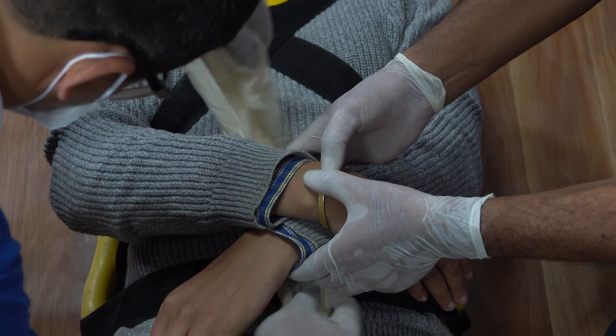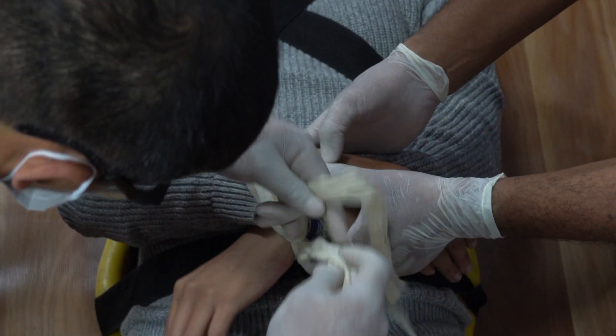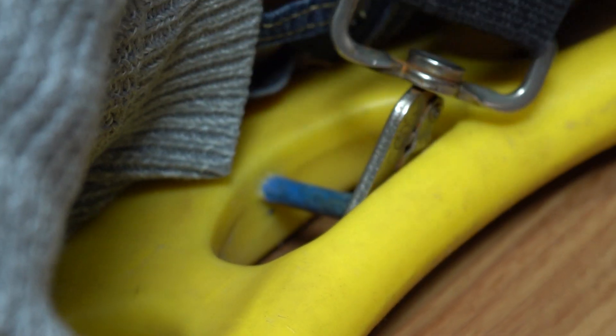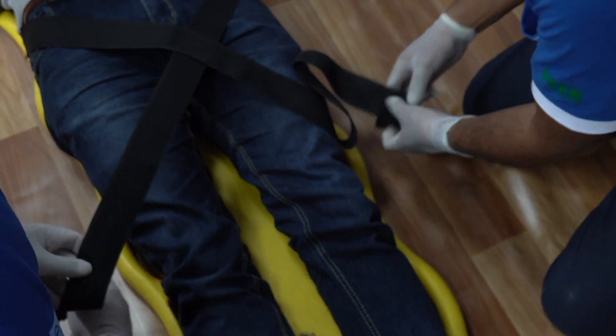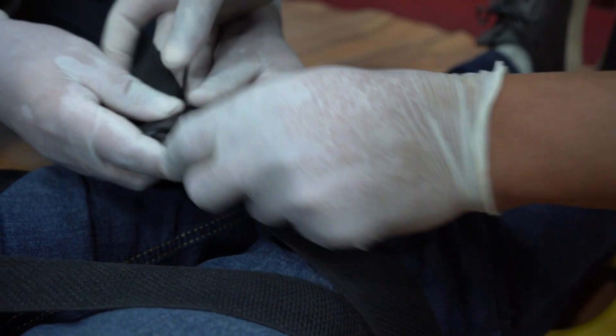If the patient is unconscious, tie the hands together over the stomach. Insert two hooks on the backboard close to the hip joint. Now secure the patient's legs.